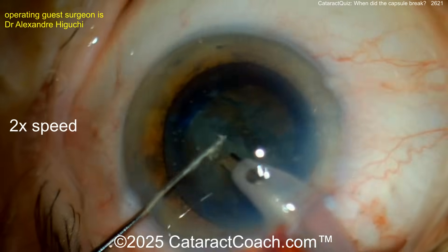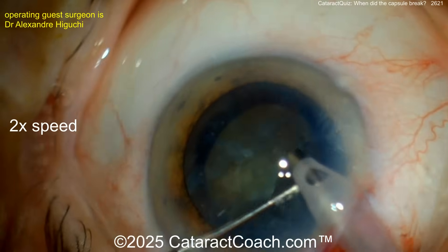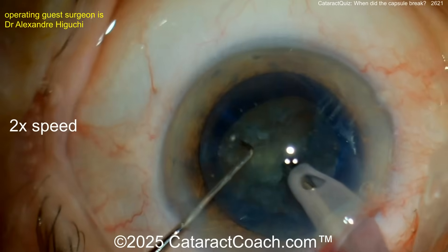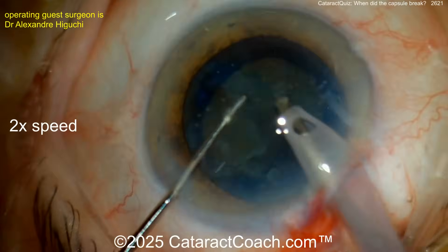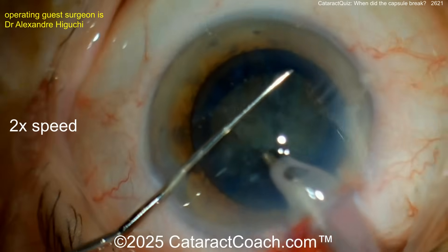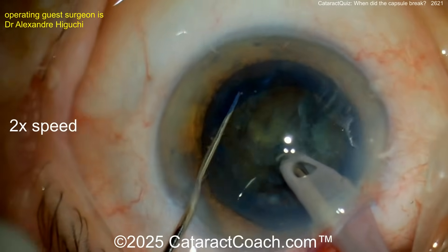Look at that — the nucleus is split open. So far so good. This is a very advanced surgeon, something to keep in the back of your head. The surgeon is skilled, not a newbie, and now splitting the nucleus again. The chops look fantastic.